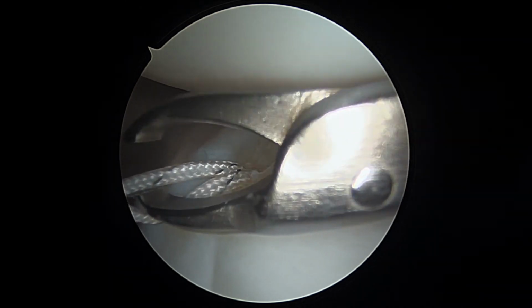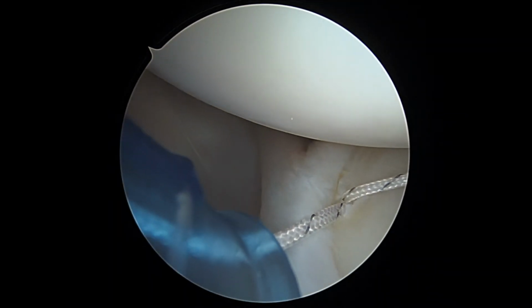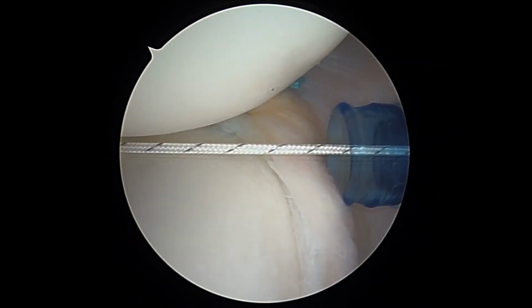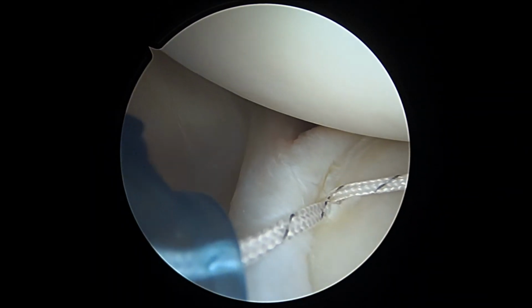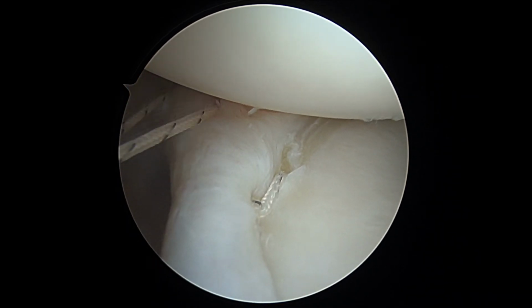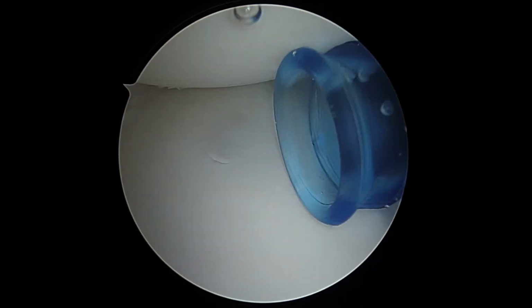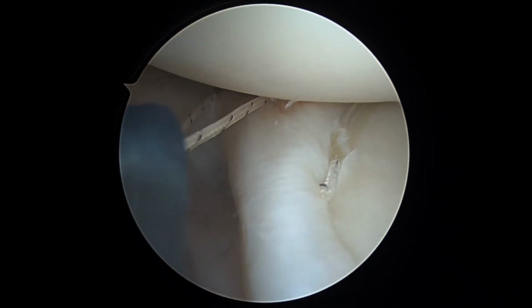And I'm going to reach in here from the back. We'll take out this first. And now we're going to get ready to basically do the same suturing technique we did in the back. We're just going to do it in the front. Okay, so we've got our first mattress stitch in the front passed. You can see it there. This is really hopefully going to tighten up that anterior band of the inferior glenohumeral ligament. We'll get this tied, show you some more in a little bit.